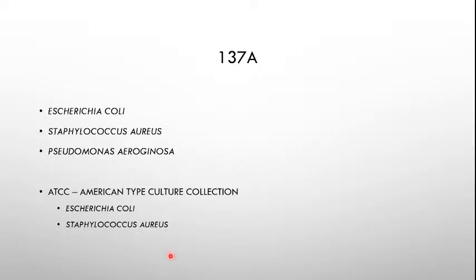What do you mean by ATCC? American Type Culture Collection. Okay, so every batch of control organisms that you're going to plant can't be organisms that you've isolated from the patient. They have to be regulated by a specific company. So if your hospital is using control organisms that have been isolated from patients, this could have false analysis. So it's supposed to be prepared by somebody else, somebody who has standards. So there's a manufacturer for control organisms also.